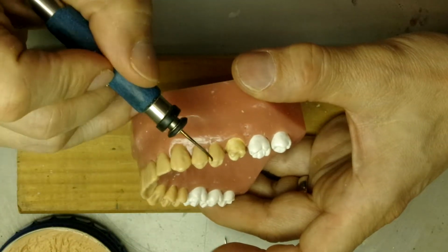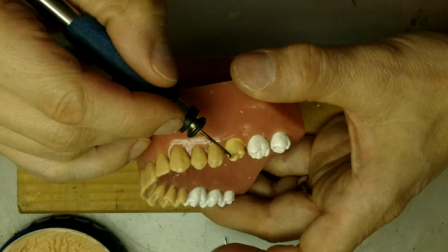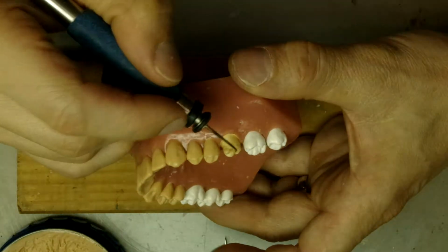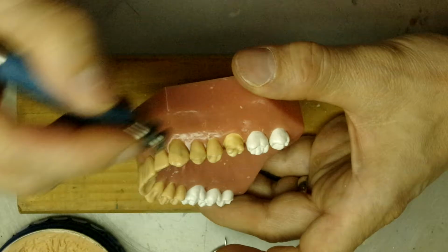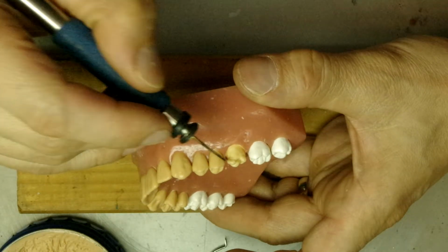Kind of draw an imaginary line between the premolars and the second molar, and that will allow you to extrapolate how high to make the cusp tips. And we go out a little bit.